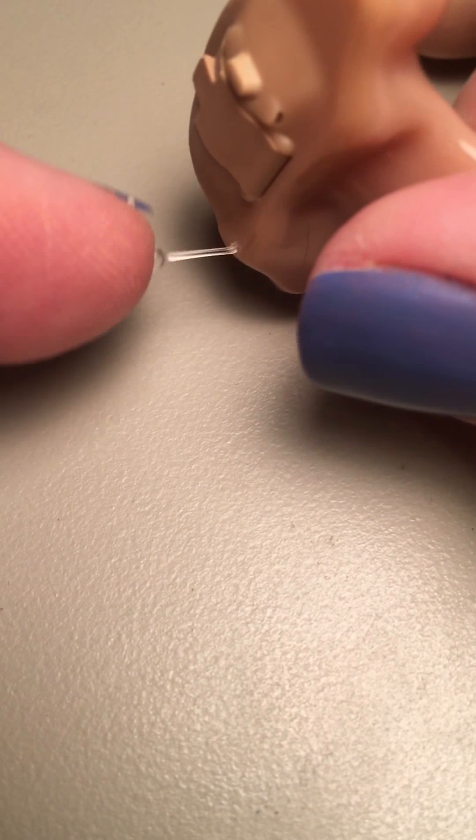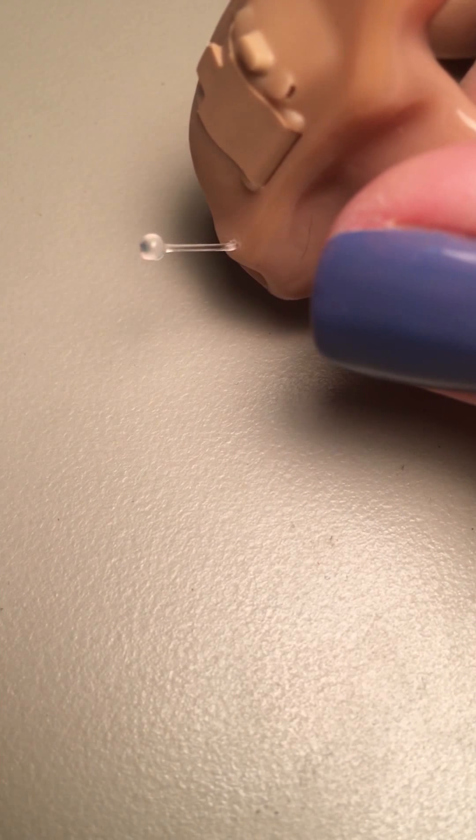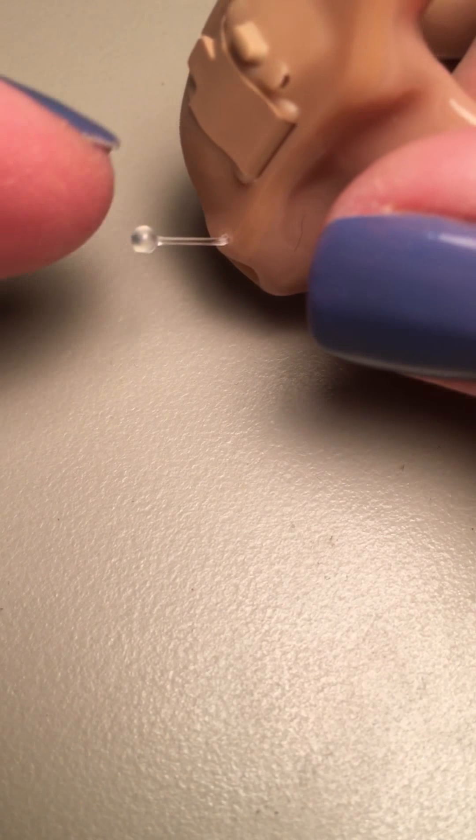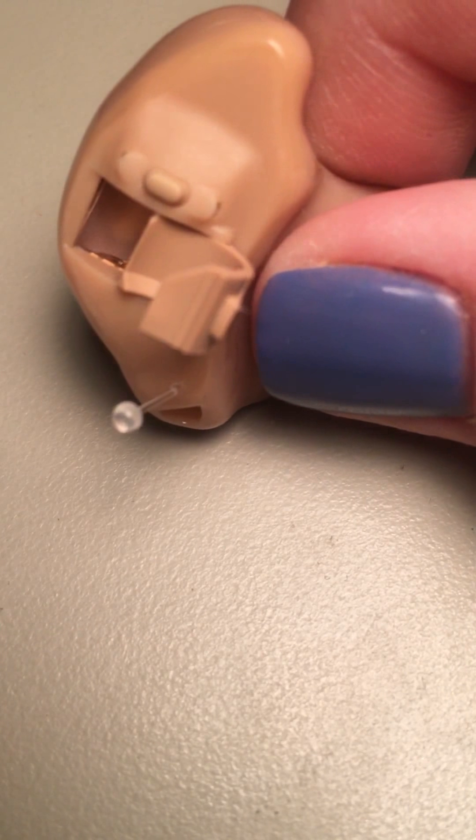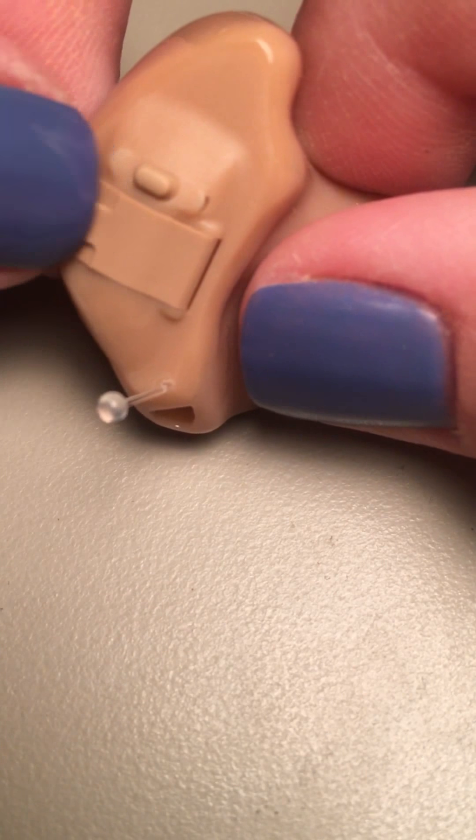That pull string is just to get the hearing aid out of the ear very easily without having to dig around inside the ear trying to pull it out. So that little thing may stick out just a little bit, but it's there to make it a lot easier to get it out of the person's ear.